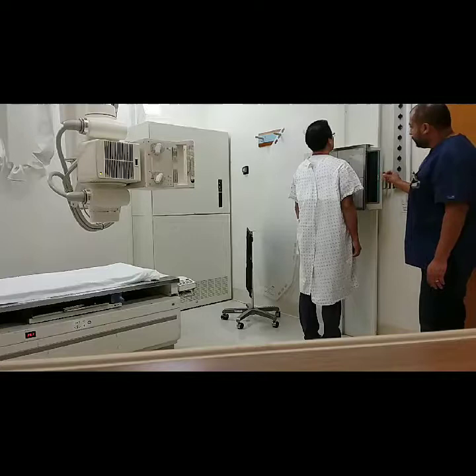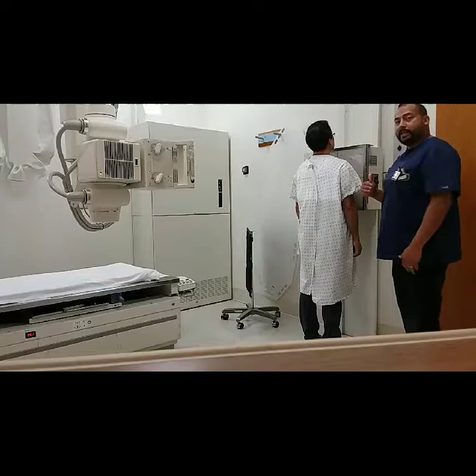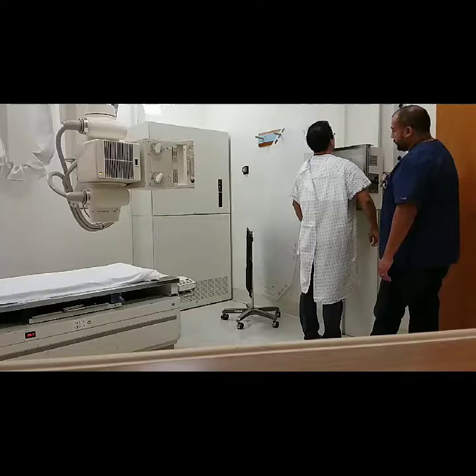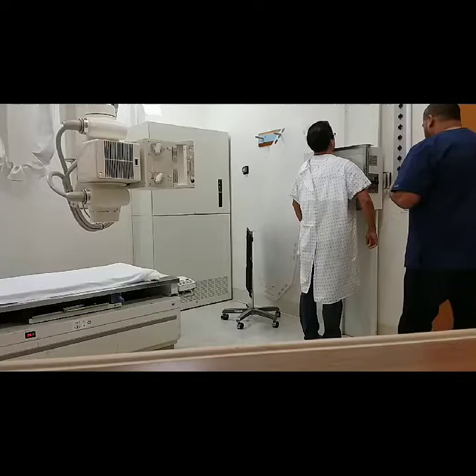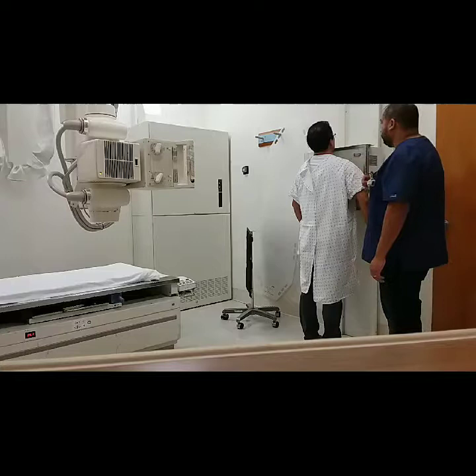Making sure we're centered to the IR. We want one to two inches of light above his shoulders, because when I ask him to do the breathing technique he will roll his shoulders forward, which brings them up slightly. I'll place our correct marker, making sure it is out of any anatomy and out of the lung field.